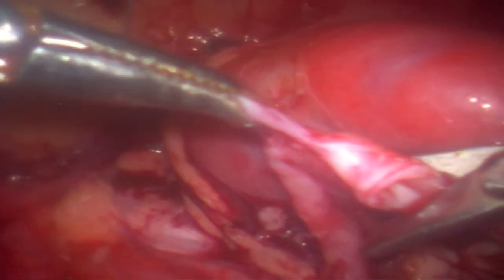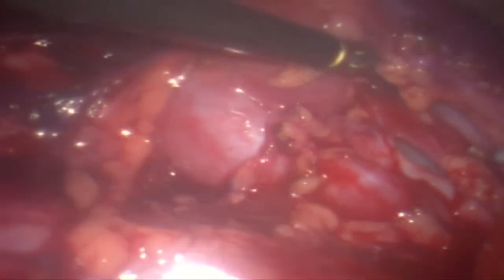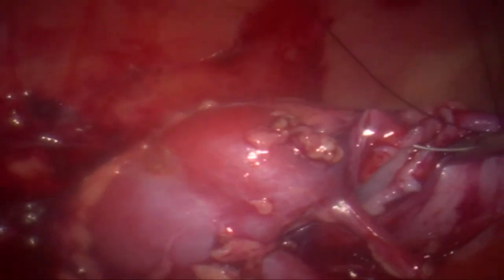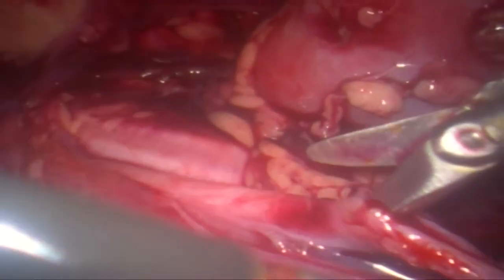We are actually dismembering it first to bring the pelvis anterior to the lower polar vessel, and the ureter has been dissected a little bit. Now the pelvis has to be hitched up with a stay. In this particular case, we needed a second stay as well to keep the pelvis opened up and get it into vision.